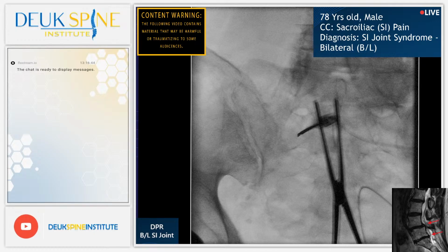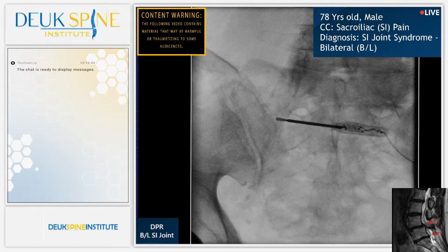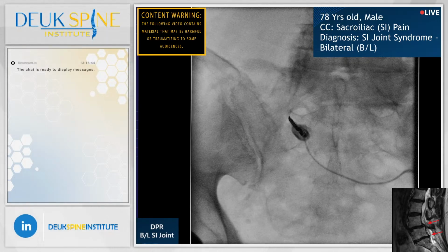Any questions? At this moment, no current questions. Shot. Shot. I'm trying to be as aggressive as I can be safely.